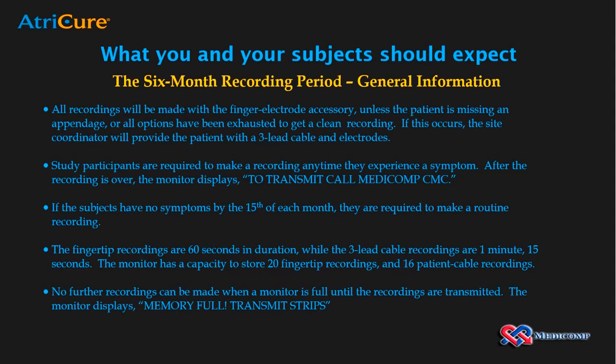The monitor has the capacity to store 20 fingertip recordings and 16 patient cable recordings. A full monitor cannot make additional recordings until those recordings are transmitted. The device will display memory full transmit strips when this happens.